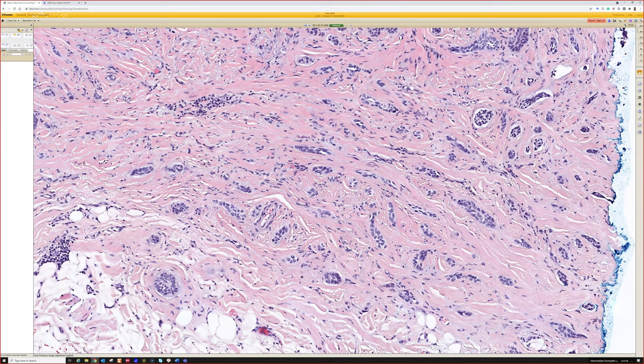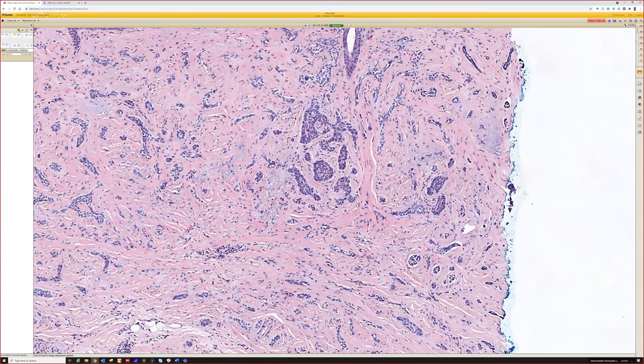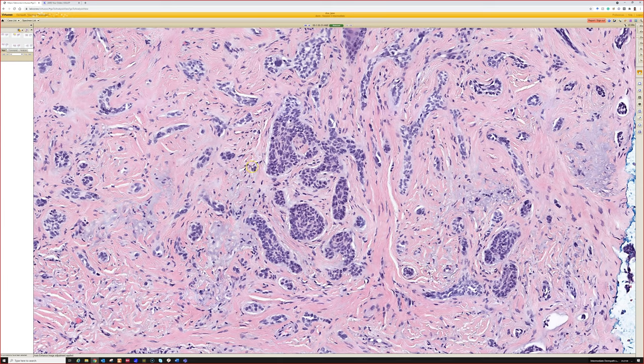Is it microcystic adnexal carcinoma? If you're having a really bad day, you could think syringoma, but usually syringoma has obvious ducts. So I feel like it's easy. But I would say the vast majority of the times when I've seen morpheiform basal cell, if you look around, there will be other areas that look more like classic traditional basal cell. So yeah, on a really small biopsy, you could struggle. You know, people include this in the paisley tie differential.